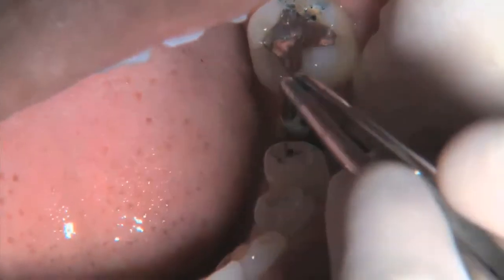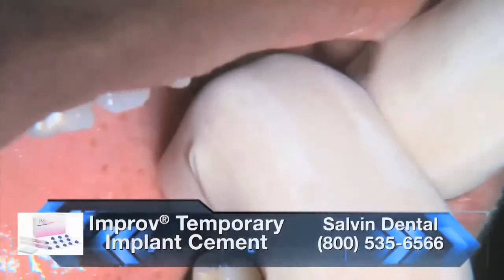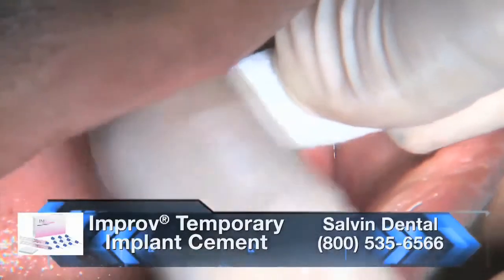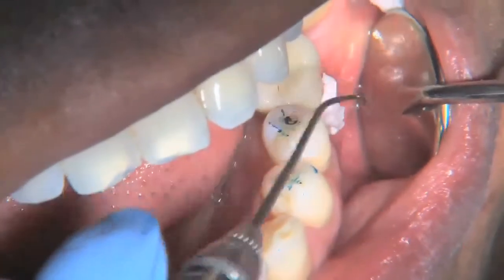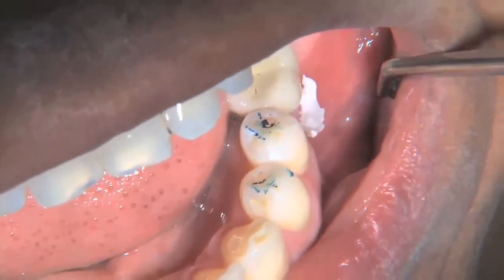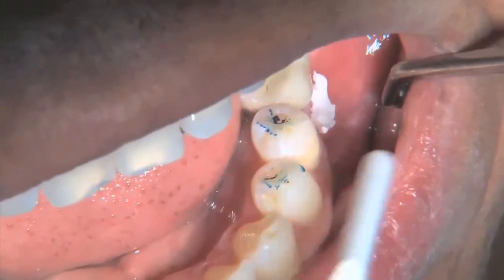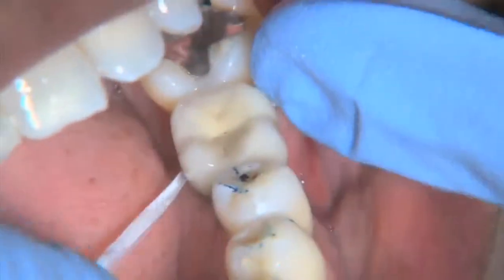The cotton pellet is covered and the screw access opening sealed. And then the crown is cemented using a thin, minimal application of, in this case, Improv, which proves to be an adequate permanent/temporary cement. In most instances, if it's necessary to remove the crown, one can do so without damaging the porcelain or the underlying abutment. Yet, under normal circumstances, the crown will not come loose in normal function.